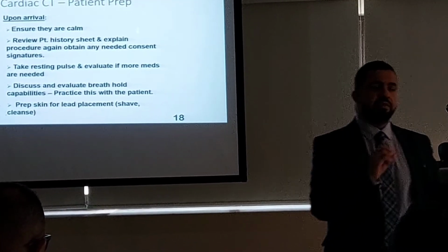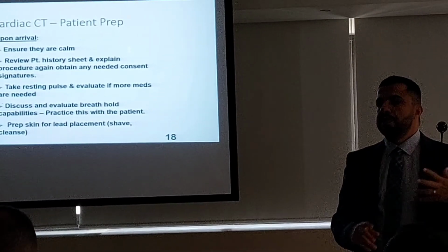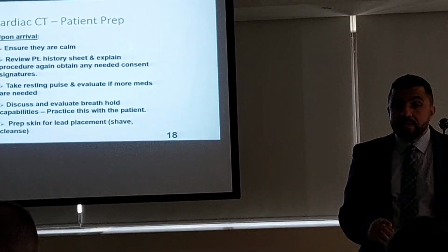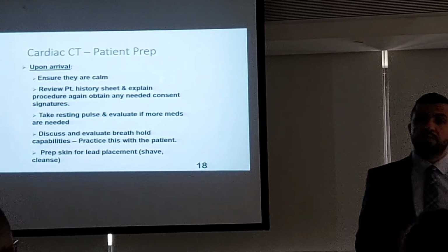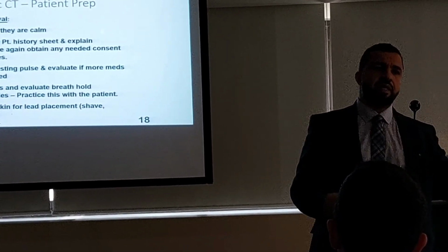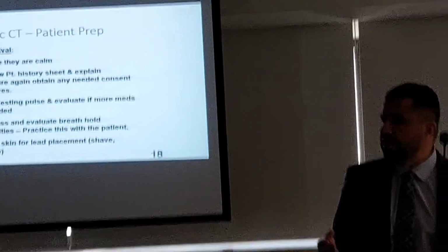I will tell him, this procedure is different from the normal CT procedures because your cooperation and following the instructions accurately has more effect on the image quality. So I will ask for that. I will ask you to take a breath-hold at home, and you will do it the same way every time. Otherwise, you may think, why is he insisting every time on this way?